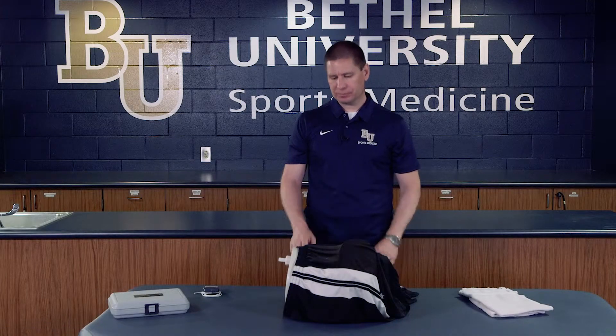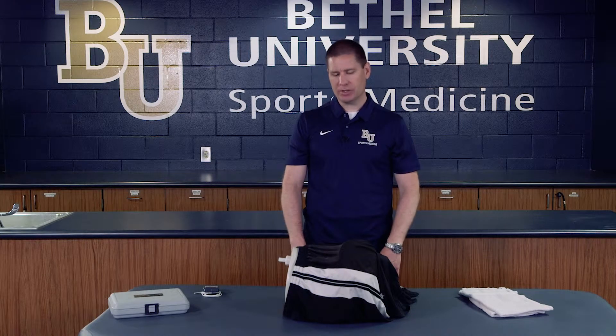This particular skill is measuring rectal temperature. This is a very important skill that all athletic trainers should be fully prepared to do in the event of any type of significant increase or decrease temperature situations, either a hypo or hyperthermia scenario. Generally hyperthermia is going to be our greater risk, so if an athlete is participating in a very hot environment, we want to make sure we're able to appropriately do this technique.